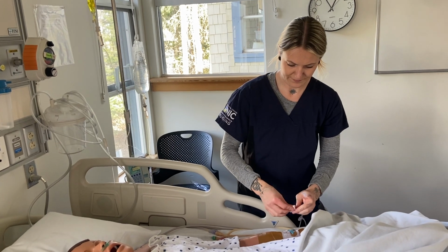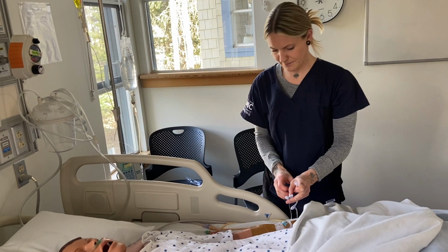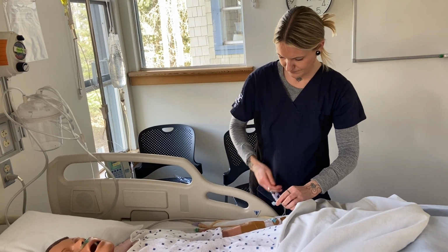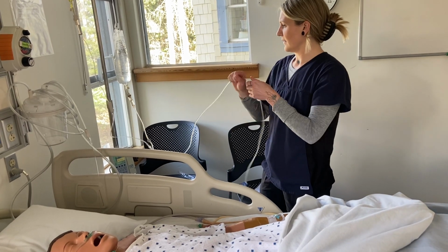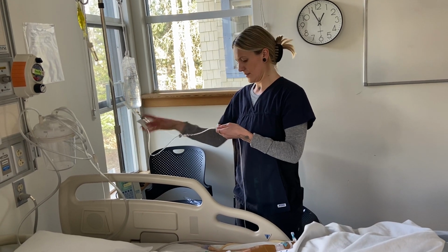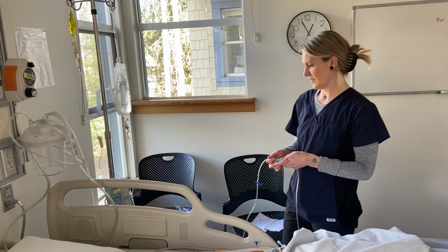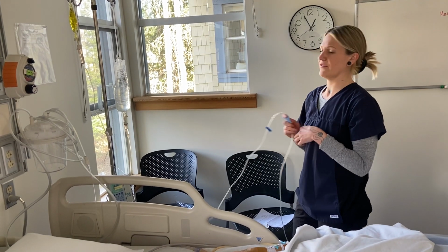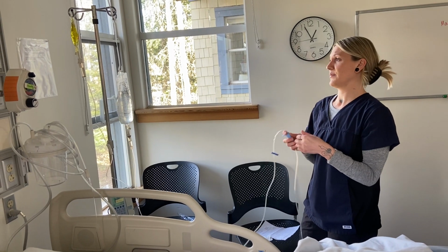And connect it. This would have a sterile cap on it normally. Okay, so I can unpinch that. And that one. And then I will slowly count my drip rate. So I need 50 drips a minute. So I'm just gonna divide that in half and do 25 drops in 30 seconds.